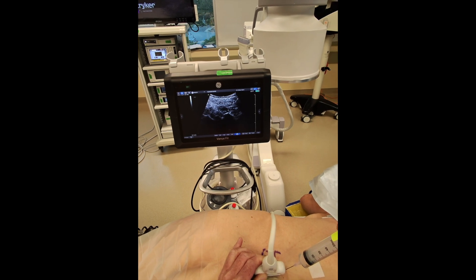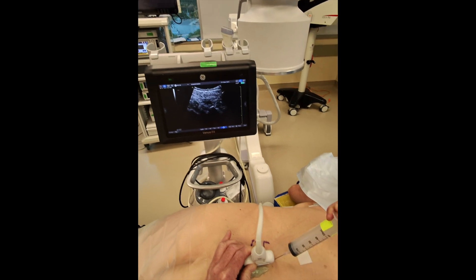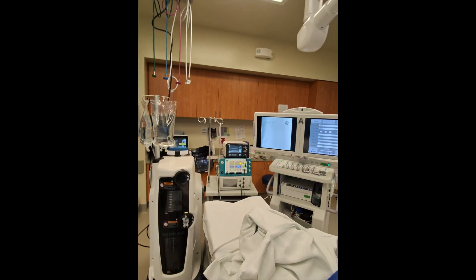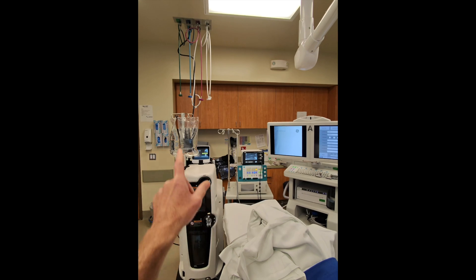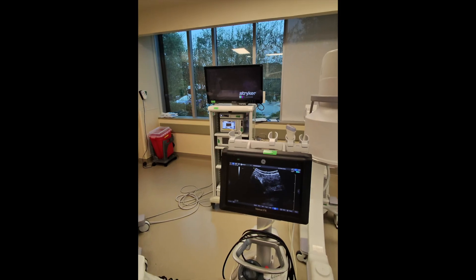We'll get a little tumescence in the tissue and some anesthetic effect by putting in 30cc's of ropivacaine. I'm currently using a gravity-based setup so those bags will go up another couple of feet, and I'm using an NSK drill, whose box is right there.